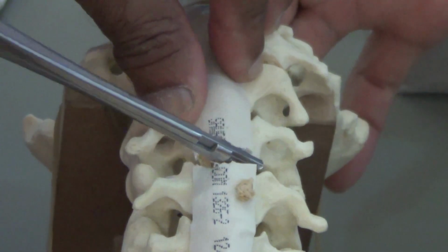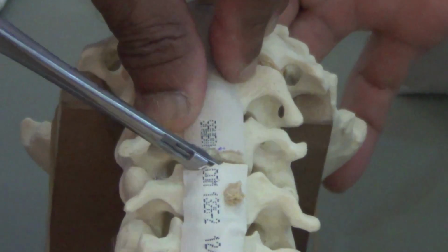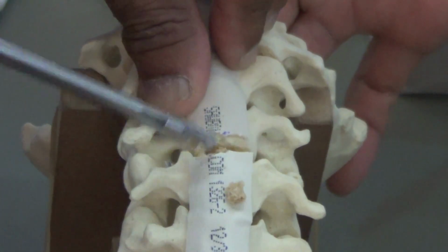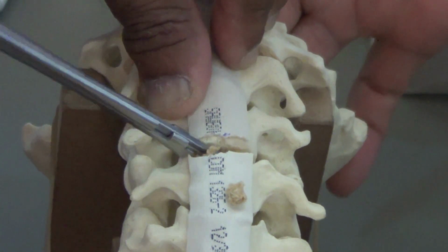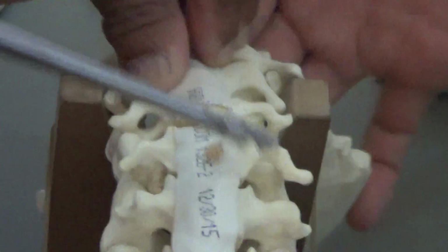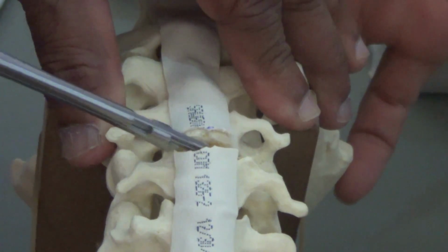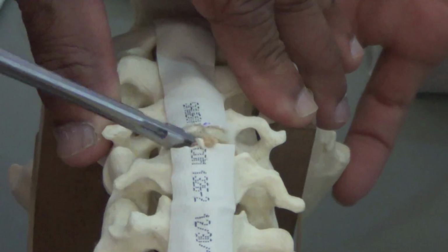Now it's important, as you take out the disc, you remember your distraction is also there. And till how much do you take out the disc? Till you see the posterior longitudinal ligament. Once you have seen it, it is important from the MRIs to see where the disc is prolapsed.